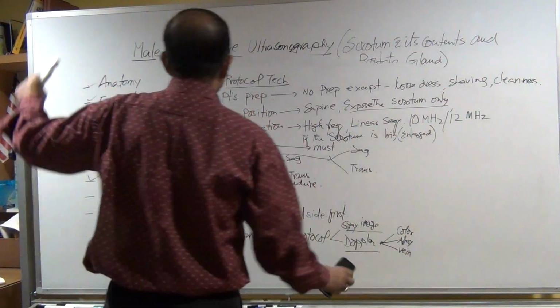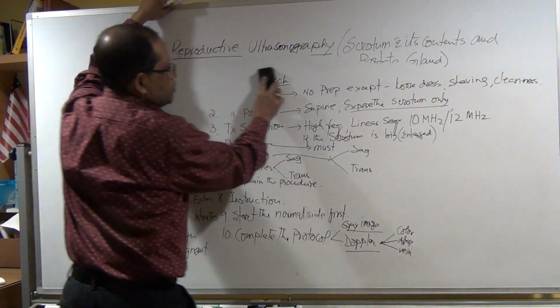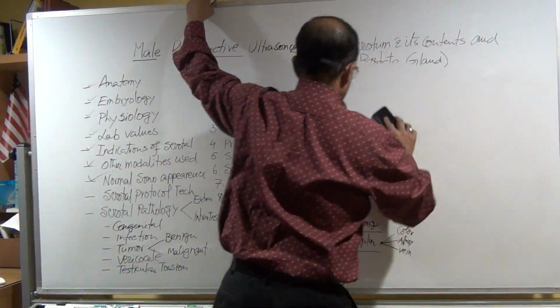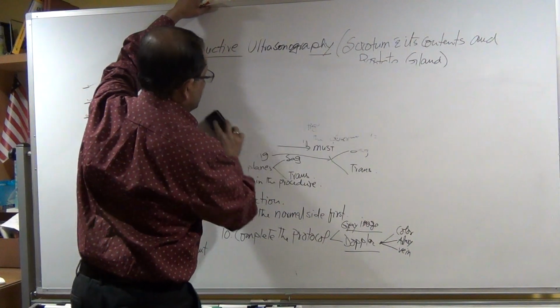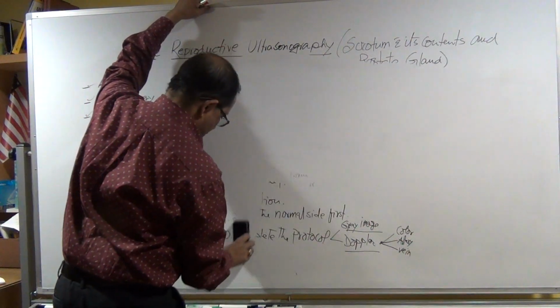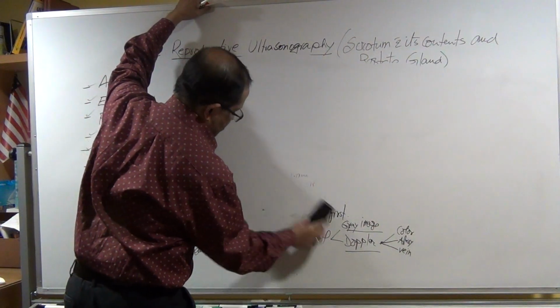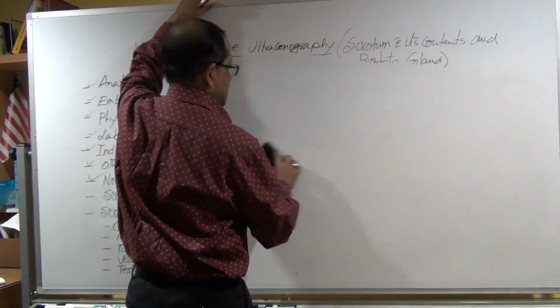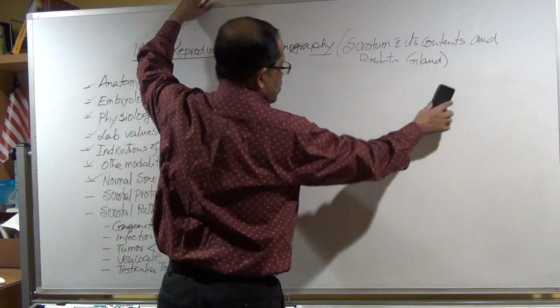Now I will give you a little depth during the protocol. You have to maintain this practice, this policy, so you will be fine all the time.